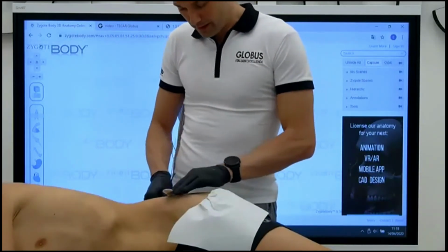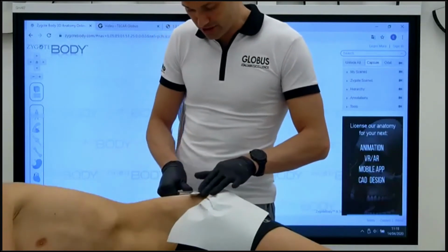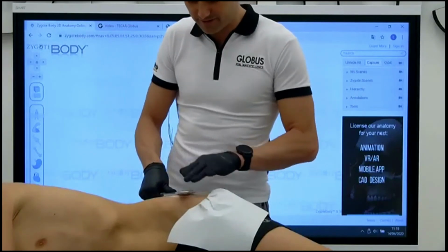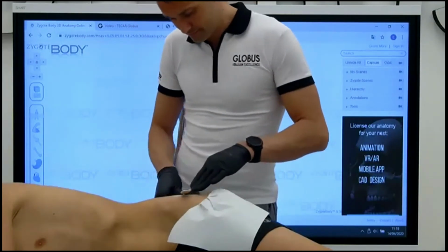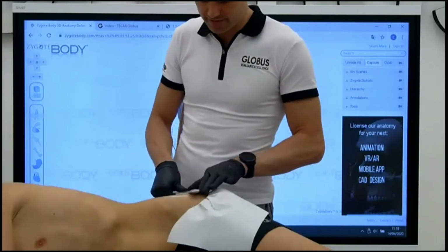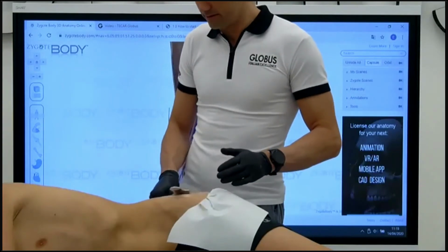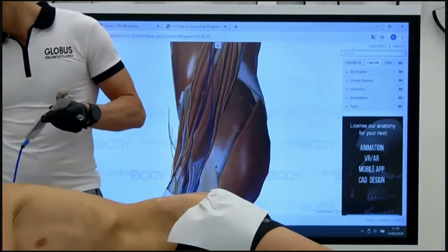So I'm not using the capacitive to prepare the tissue. I'm just going straight with the fascia tools, without using the edge, just the flat area, until he reaches a 7, for example. Tell me when you reach 7. Okay, here we are? Yes. We had a very gentle sensation of warming.